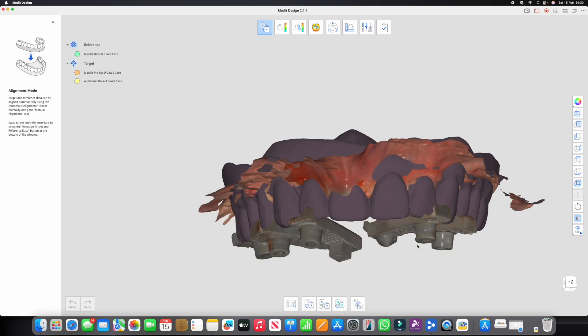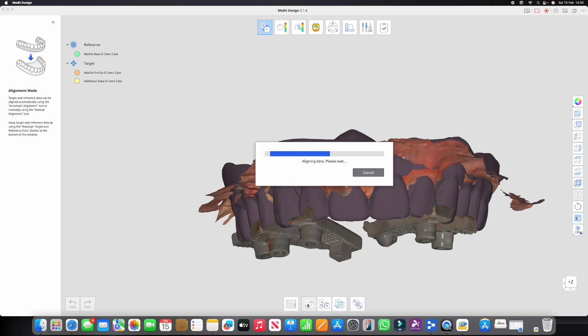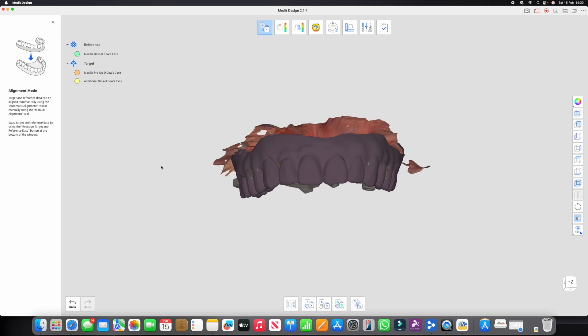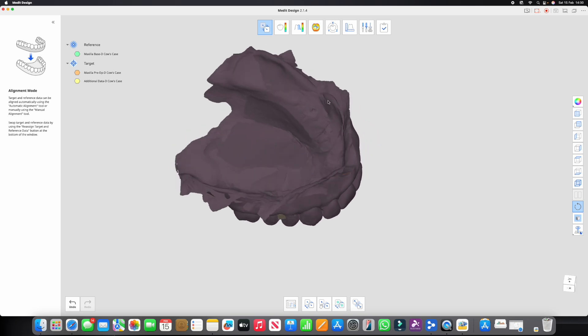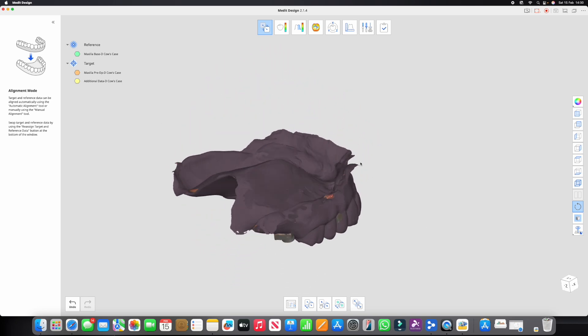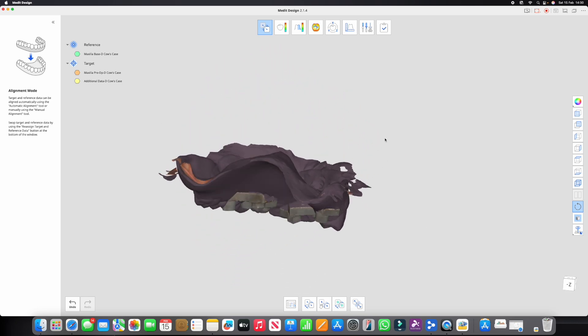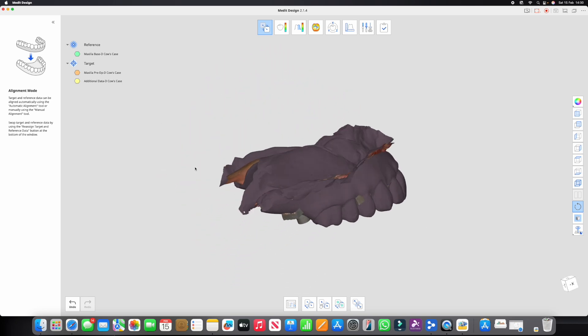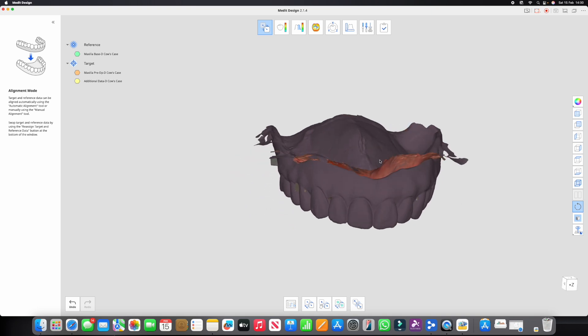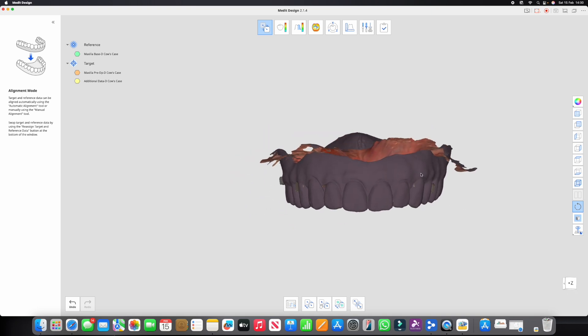Bang, there we go. Nice and easy. Let's rotate it, let's have a look, and yep, that is all beautifully aligned. Okay, so that's all now aligned to the inner surface of that denture.